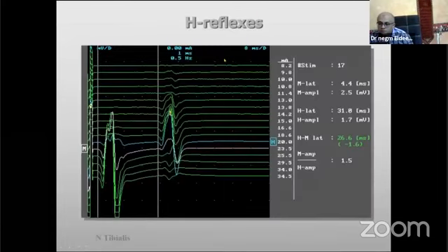The H reflexes can be done mainly for a few levels of the spinal cord, both in S1 and in C6, C7. Here is H reflex in tibial nerve, slight stimulation. We start to see the response here. Here are the late responses, and then we increase the stimulus strength so that the CMAP increases, and you can see how this disappears more and more.